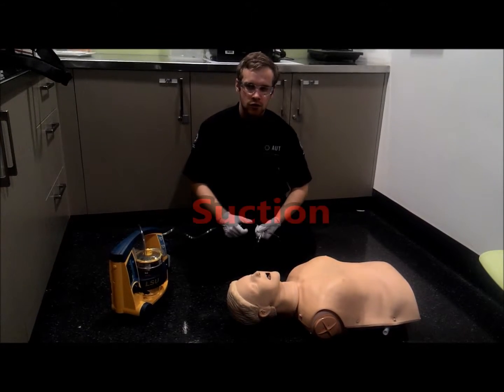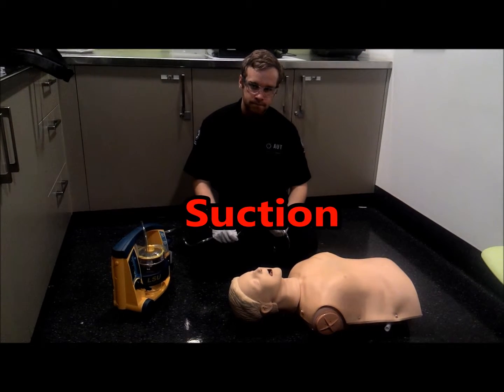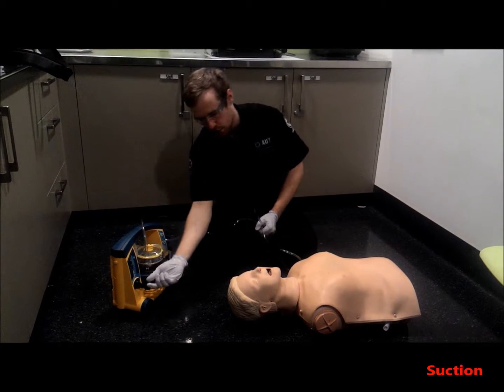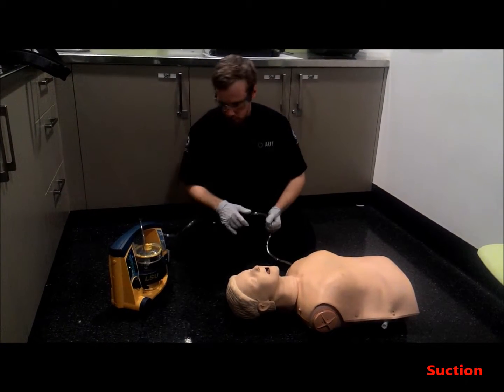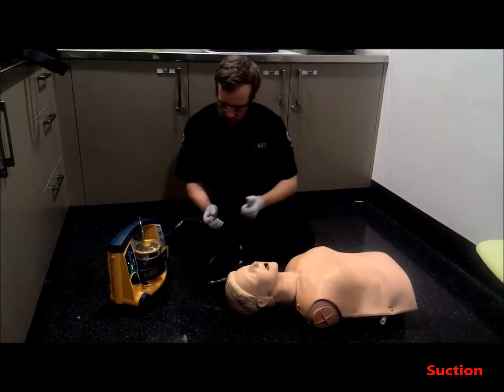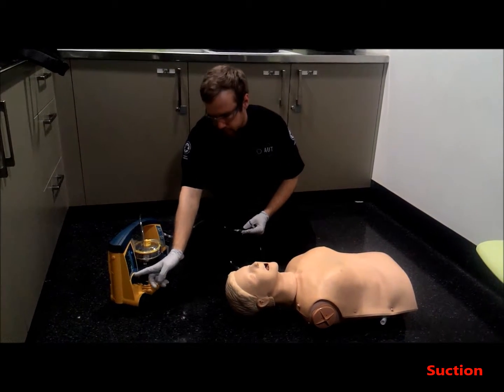So now I'm going to demonstrate proper use of suction. First of all, you need to check that your machine is working. So you do this by turning it on and obstructing the tubing, making sure that the meter rises. So that's all working perfectly.